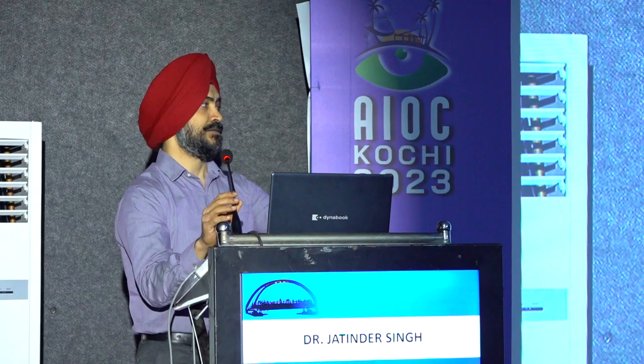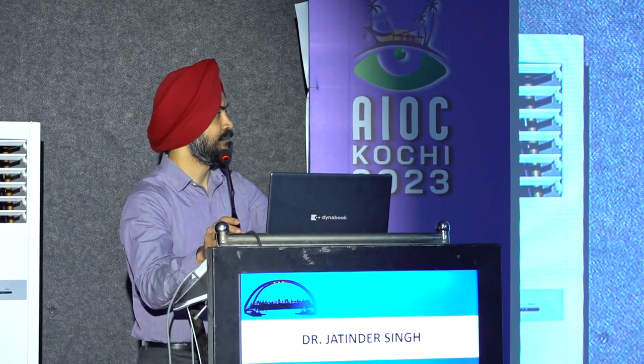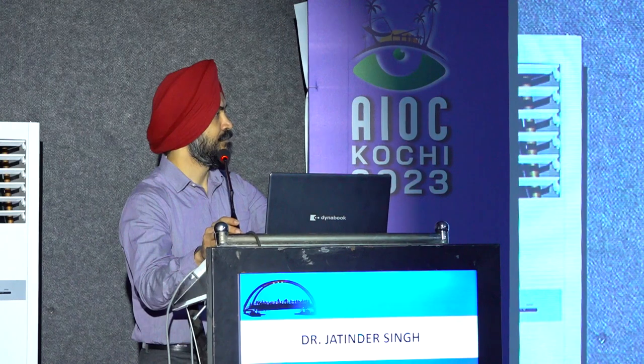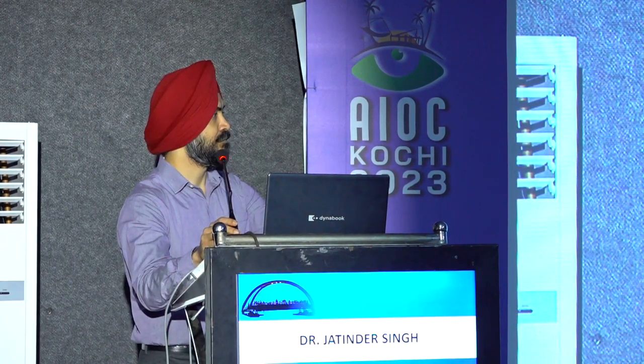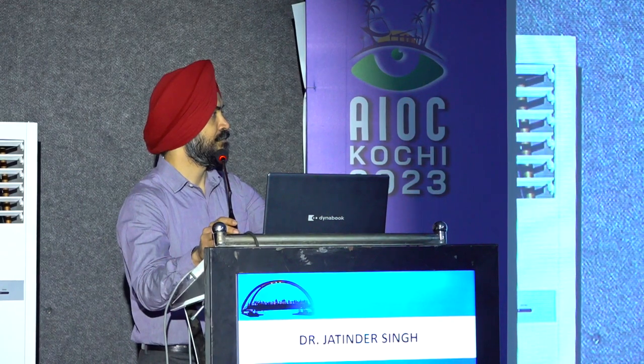That's a valid suggestion, but sometimes you don't have to wait for 5 days. What we do is, if you see more than unusual bleeding, I do two things. One is stop, don't disturb that area, and second is realize that probably we have touched a new vessel, because massive bleeding will not come from a normal vessel. Normally it comes if you touch a new vessel or you create a break in a vascular retina. So you stop there, go to the other areas where you can still see, start detaching the vitreous from the periphery, finish your other work and do it at a higher perfusion pressure.